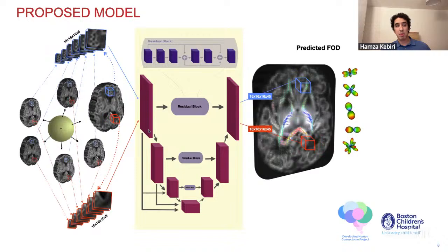And the main goal here is really not to innovate on the architecture, but we still aim to add these extensive residual blocks, because the input information is very low, we are only using 6 directions, while what we want to predict is very high dimensional.